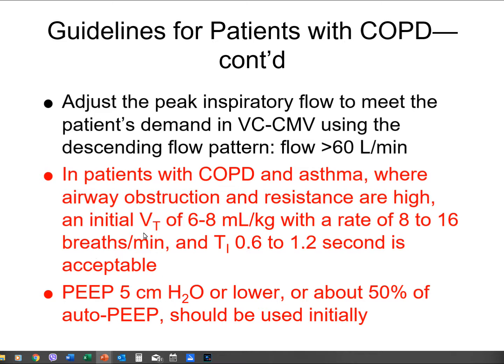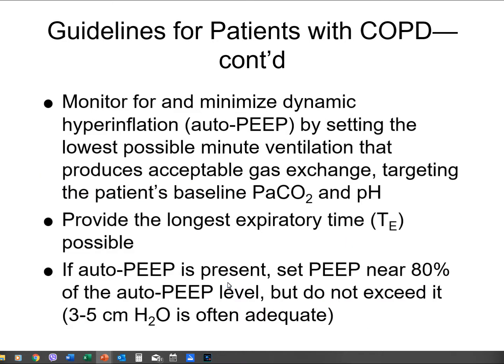We had talked about increasing the PEEP up to the level of their auto PEEP so it decreases their work of breathing. That can happen, but you can also adjust respiratory rate or increase flow to help them breathe better.